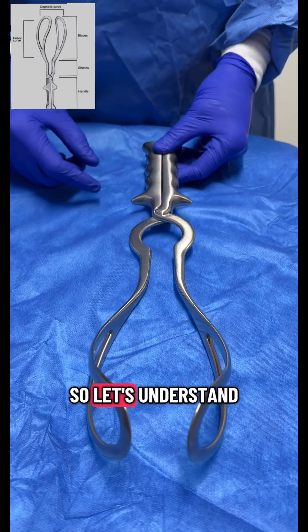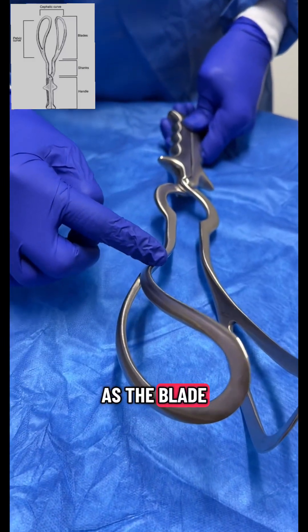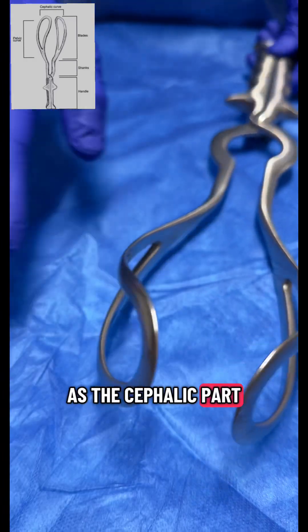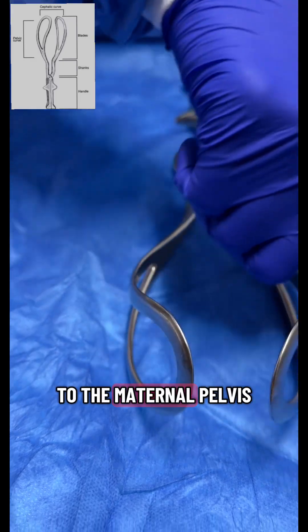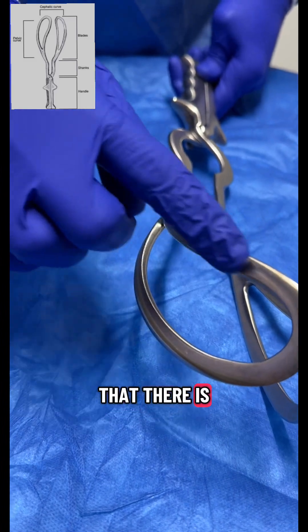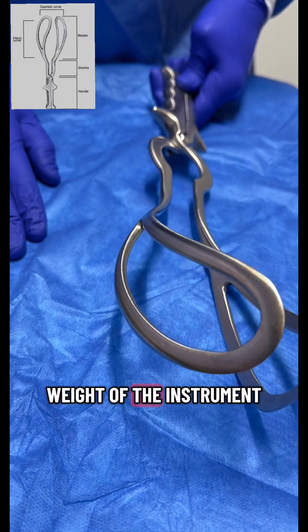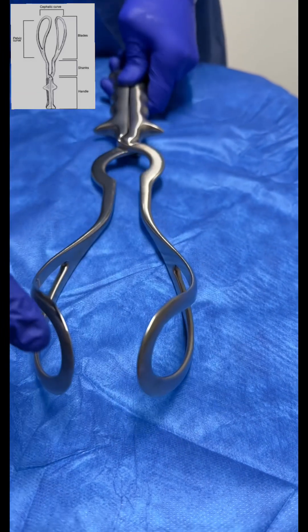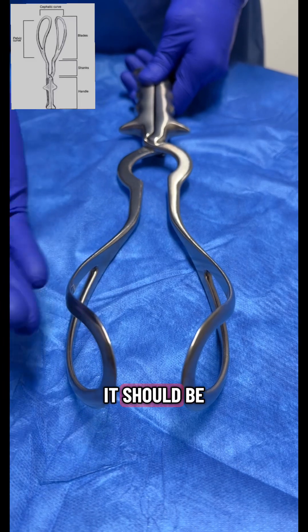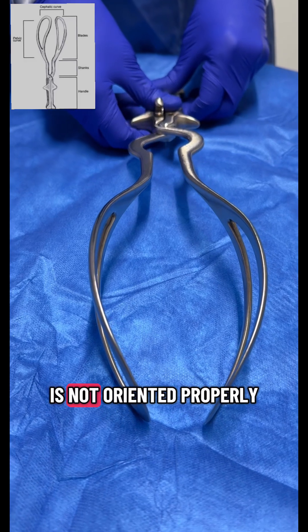This instrument is the Nibail Barnes forceps. The blade has two parts: the outer part is known as the pelvic part and the inside is known as the cephalic part. The outer part lies parallel to the maternal pelvis and the inside lies close to the baby's head. The large hollow space inside is known as a fenestrated blade, which reduces the overall weight and gives a good grip on the baby's head. The tip of the blade should be facing upwards; if it faces downwards, the forcep is not oriented properly.